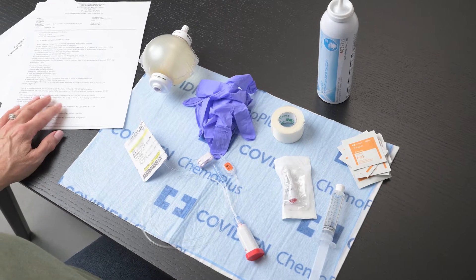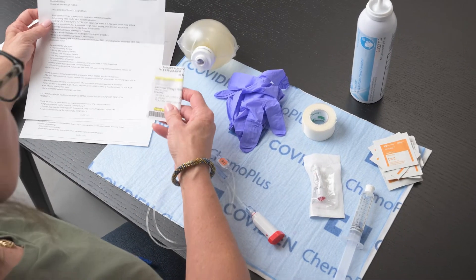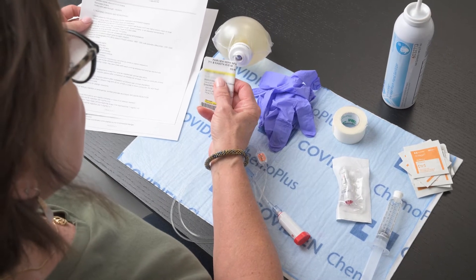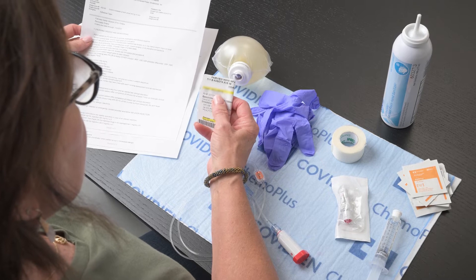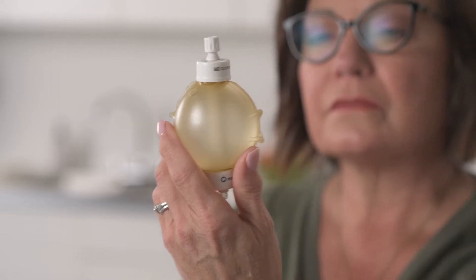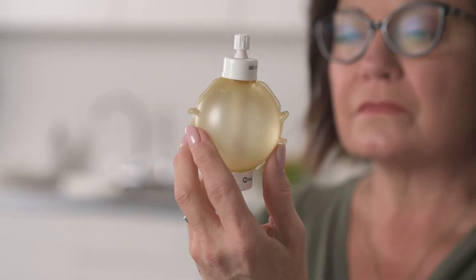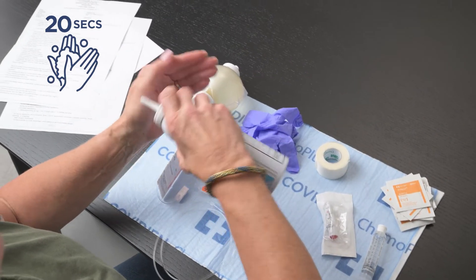Once you have all your supplies together, compare your orders with the label on the medicine ball. Check for correct patient name and birth date, correct drug name and dose, look for the discard after date on the label, and look for any leaks or floating specs. If there are any concerns, call Fairview Home Infusion to report the issue. Wash or sanitize your hands again and apply gloves.